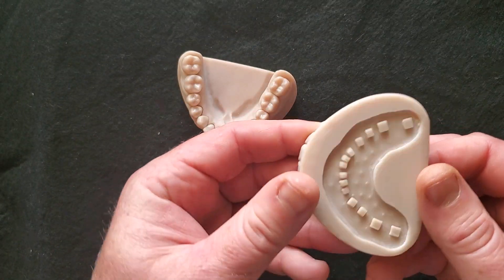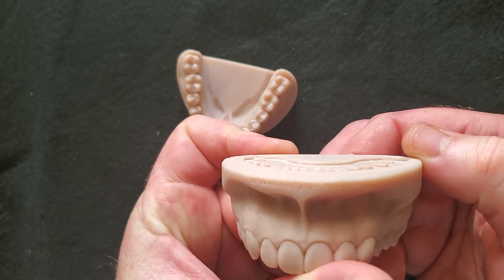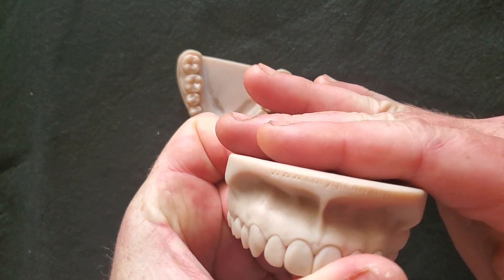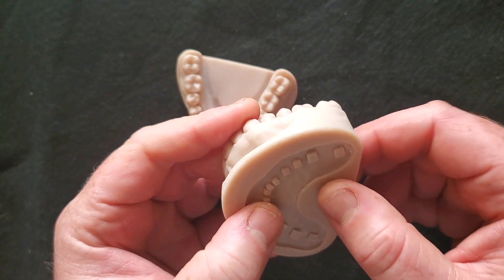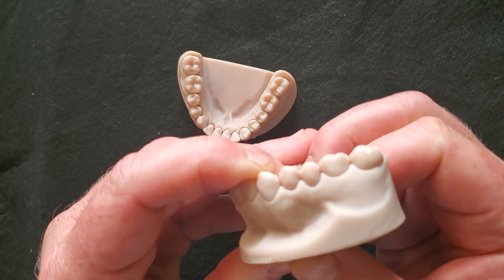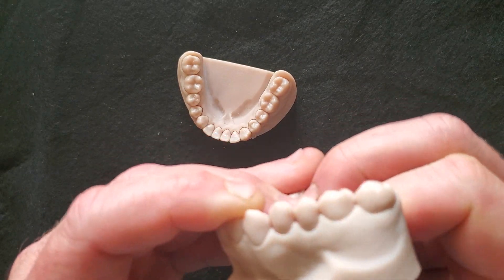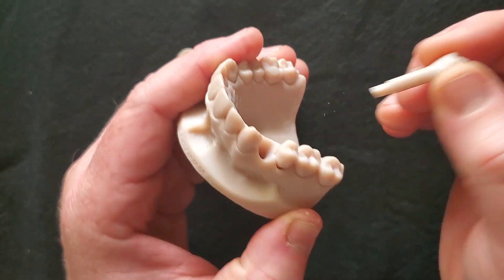If you need to switch them out, they're designed such that there's a peg sticking out the bottom. It doesn't stick out so far that it prevents the model from sitting flat. Whenever you are ready to switch the teeth out, you can simply push from the bottom — and you hear that little pop.